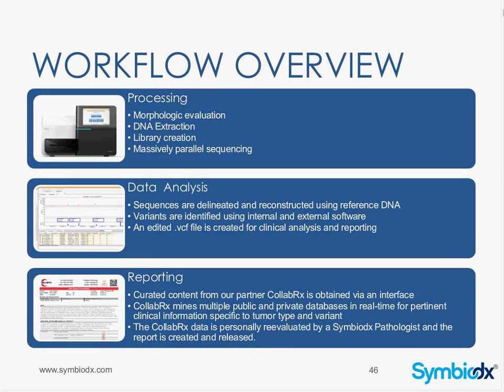So the first thing we do is look at the slide, identify the area for extraction, perform the DNA extraction, do the library creation, so this is adding the adapters and getting the sample ready to sequence, and then the massively parallel sequencing itself. This process takes about 5 days.